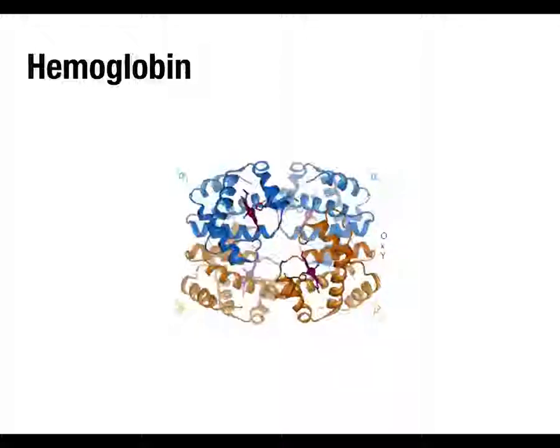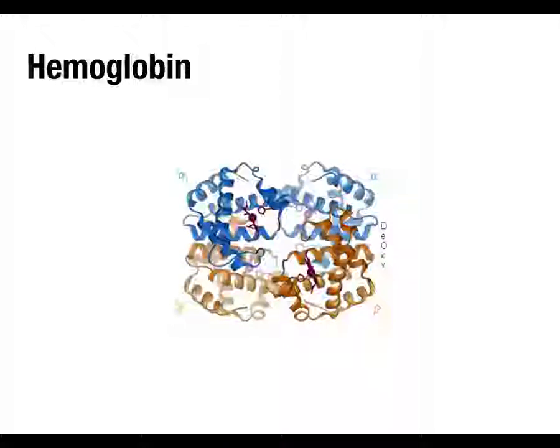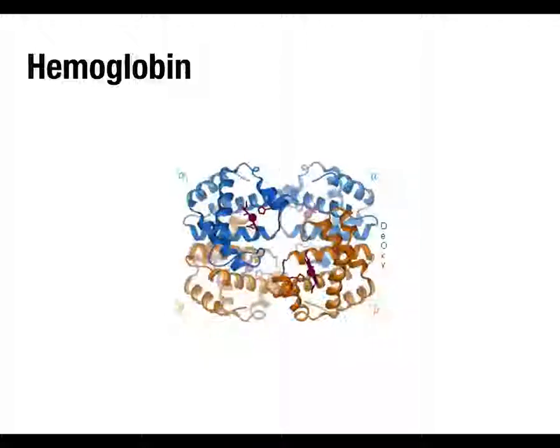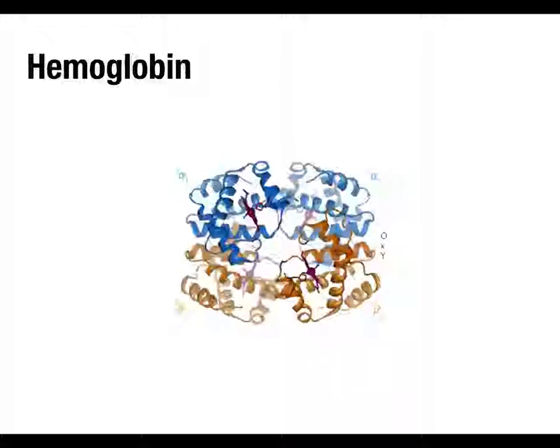And doing things like slice selection we do by creating magnetic field gradients that actually change the strength of the magnetic field systematically across the brain so that we can tune our radio frequency pulse to a particular Larmor frequency and excite a particular slice. And so when you've got something in there that's disrupting the magnetic field, the effect of that is to actually sort of disrupt the MRI signal quite locally.